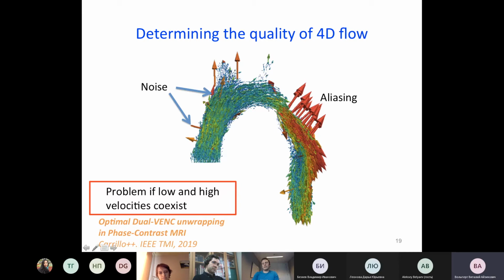No, it's the aliasing. This is a synthetic data set, so we aliased it explicitly to show this. The highest component of the velocity is the vertical one, and you measure the components separately. When that component is aliased, it swaps, and when the others don't, you basically see some kind of 90-degree rotation. You can have aliasing in all components, but aliasing usually happens when the velocity is highest, which here is the vertical component. That's an excellent question.